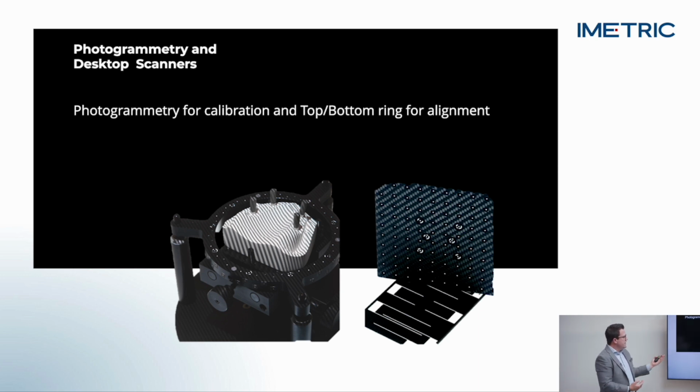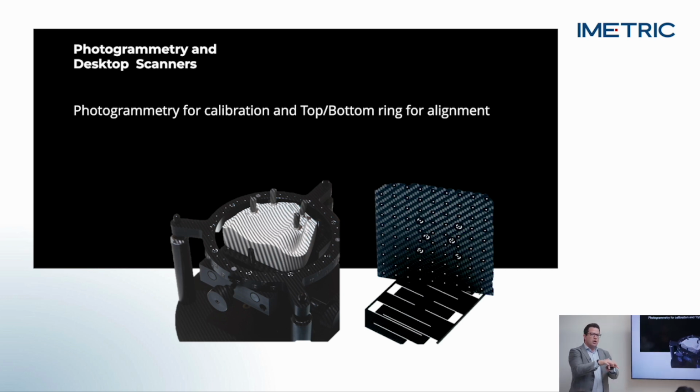So that's kind of where we started out. But Horst, who's our CEO, realized that when you're scanning a model like this, there's a lot of what we call tolerance stacking. So I live in Phoenix, Arizona, right? If you take an impression for a patient in Phoenix and it gets thrown into the back of a courier's car to go to the lab, what happens to that impression? Changes shape, right? So then it gets to your lab and you pour that impression up in stone. What have you now introduced?